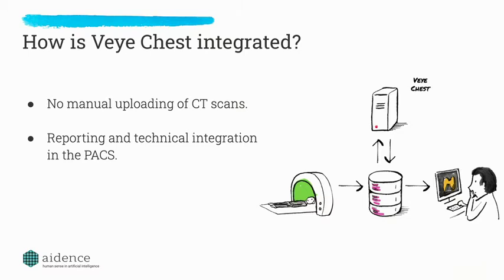I think we're all aware of the hype around AI of the last few years, and of course the AI algorithms themselves are exciting, this really amazing new technology. But to get from developing an AI algorithm to actually being really useful in clinical practice, what we've worked on is understanding where it fits into their workflow. That's a big priority for us. And yes, it involves developing other bits of maybe less exciting software, but ways that you can fit into the workflow so that we don't disrupt their normal day.